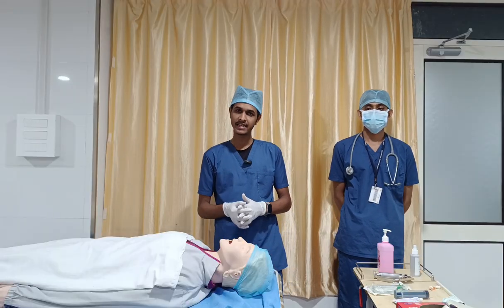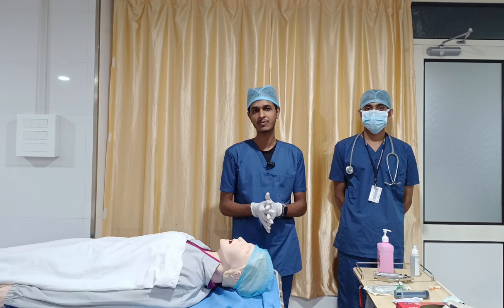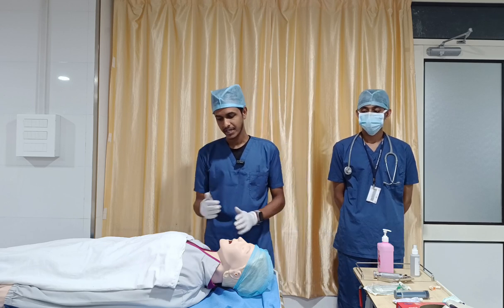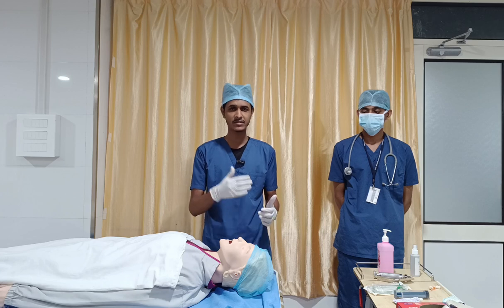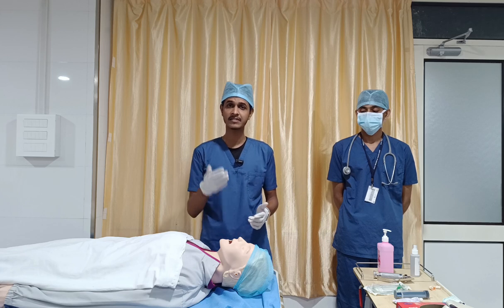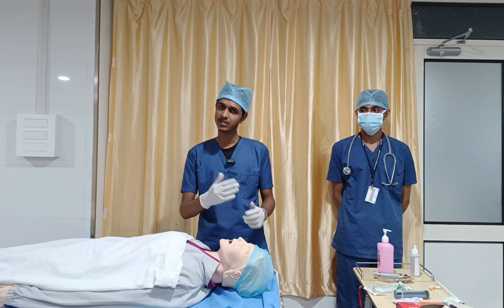Before getting into the procedure, as usual, you have to don your PPEs, and then perform hand wash. Make sure all things are at your hand side itself. Then coming into the procedure, first you have to do the local examination. We told a lot of contraindications: oral bleeding, massive oral bleeding, any facial fracture, basilar skull fracture. By inspecting the person, you have to think about those.